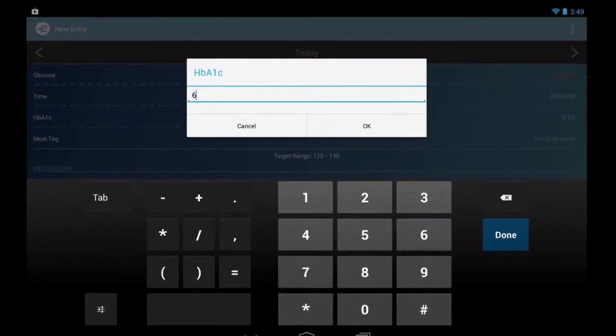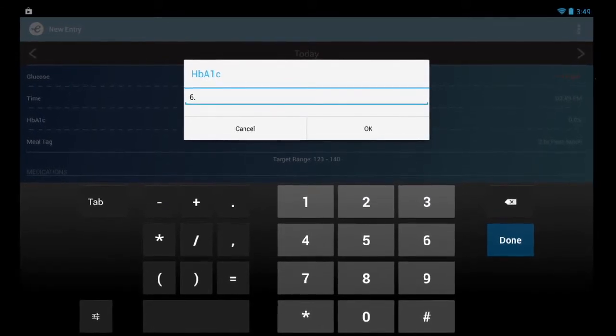It's generally recommended that you have an A1c test every three months if your blood glucose test results are not yet at your goal, and twice a year if your blood glucose tests are at your goal. You can enter your A1c test results into the e-wellness glucose tracker as well.